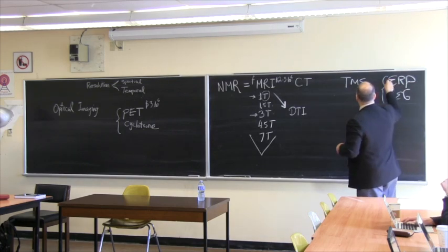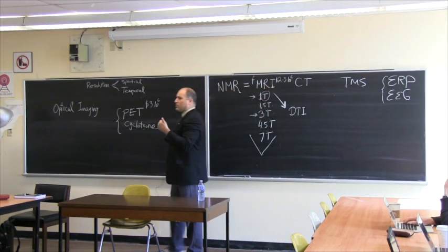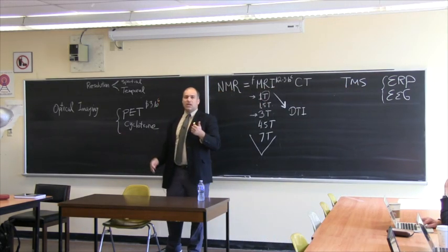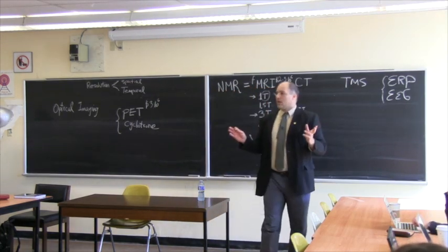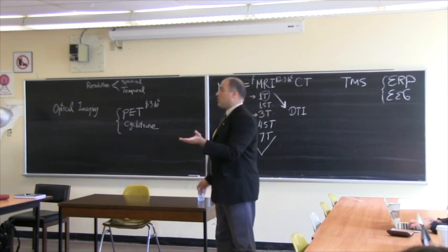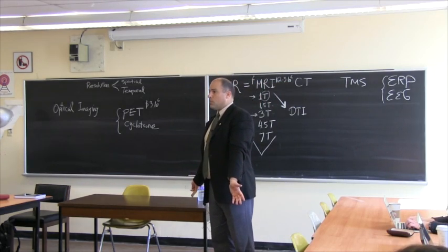When we started doing EEG and ERP, we used one electrode for grounding, which is like the baseline or the base activity, and 2, 3, 4, 5, 6 electrodes for collecting information. Now, you already see, just from listening to me, that there are many, many disadvantages to ERP. What are they?